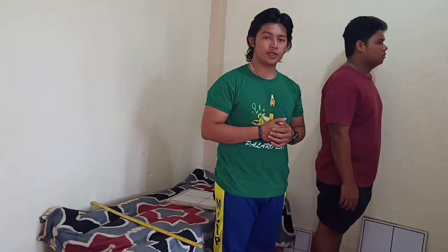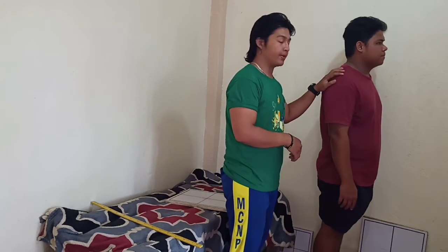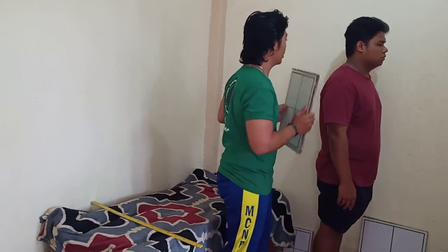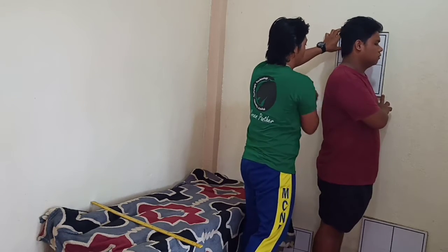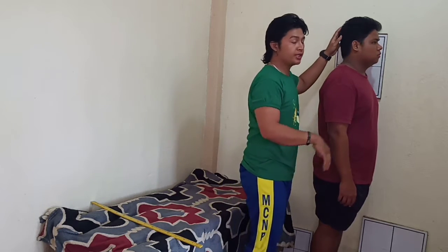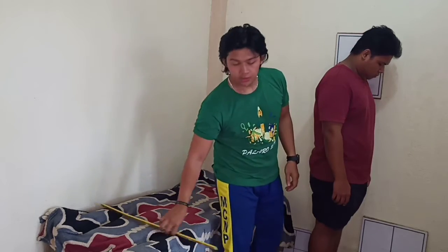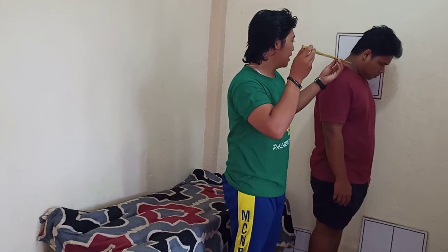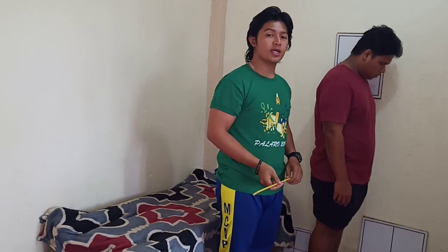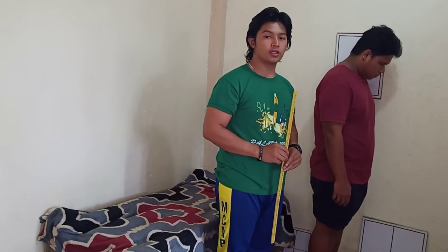The second projection of the cervical vertebrae is the lateral projection, hyperflexion and hyperextension. First, place the patient in lateral upright and use 10x12 image receptor and center the image receptor at the level of the C4. And draw the chin down and close to the chest. The central ray must be perpendicularly directed to the level of the C4. The structure shown in this projection is the spinous processes elevated and widely separated, and all the 7 cervical vertebrae in lateral.